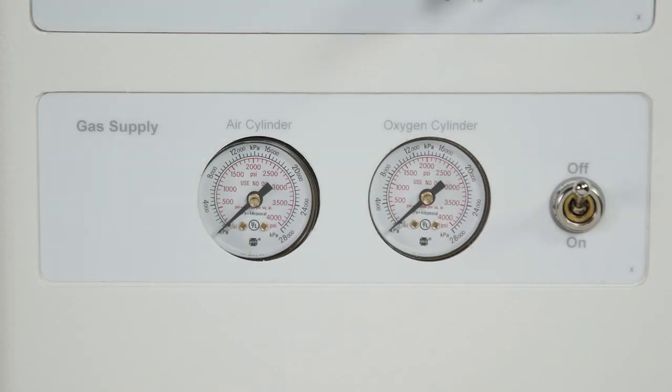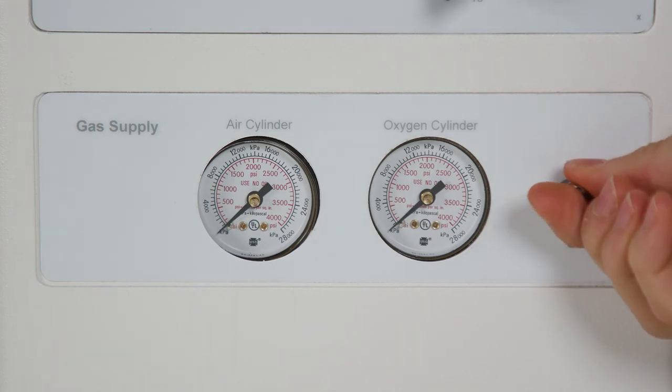The optional gas supply module is used to display the oxygen and air supply pressure. Depending on whether a blender is installed on the Resuscitaire, either one or two gauges are installed, but both will come with an on and off switch.